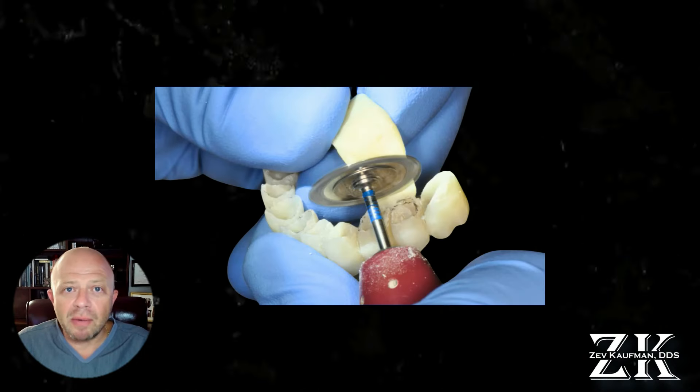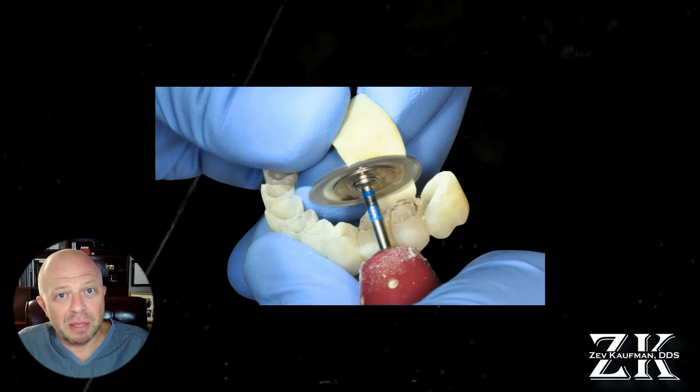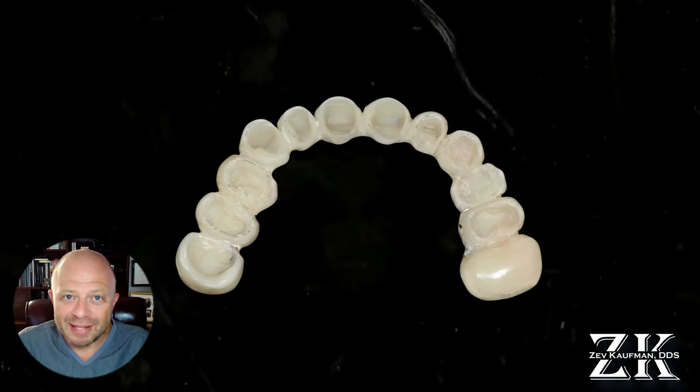We went from this to this. Let me show you a crazy reconstruction I did more than 10 years ago.